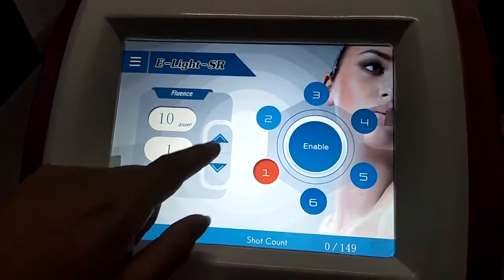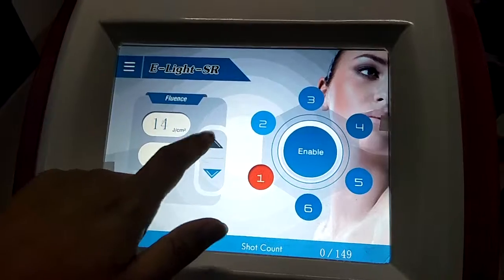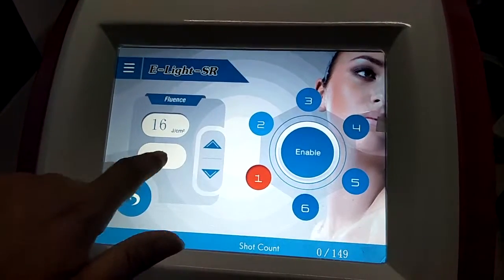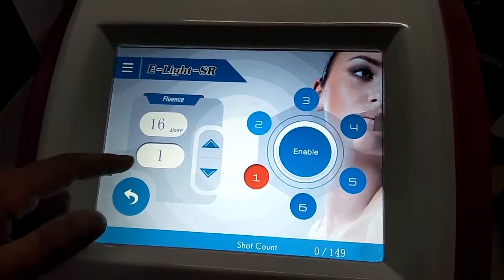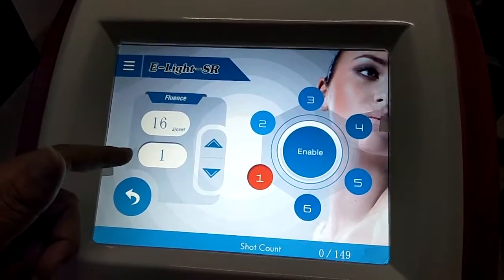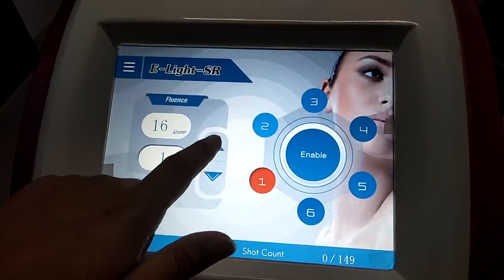Here we can choose the IPL energy, which ranges from 10 to 50. And we can also adjust the RF energy, which ranges from 1 to 50.